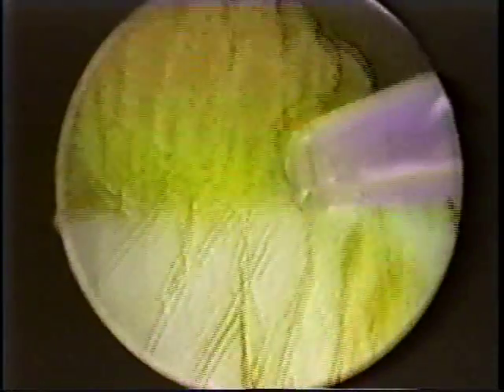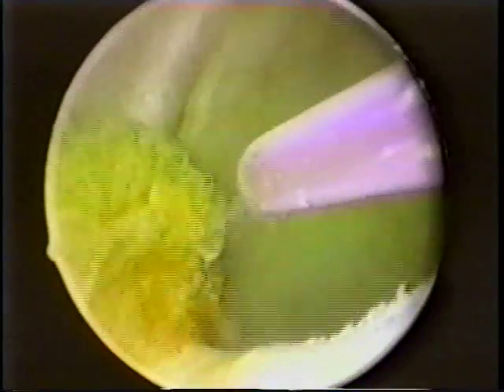When the laser is used as a near contact laser, approximately one or two millimeters away from the surface of the bladder, it can be used like a blowtorch to obtain hemostasis and to burn away papillary lesions.